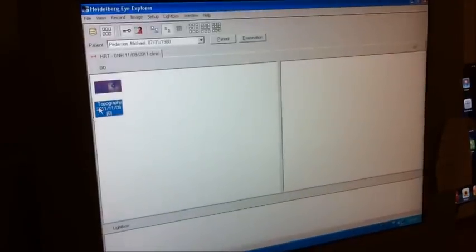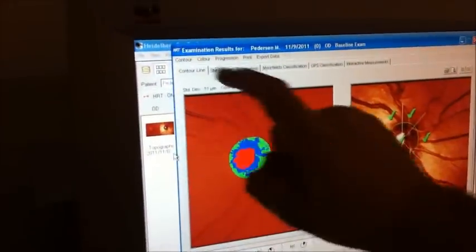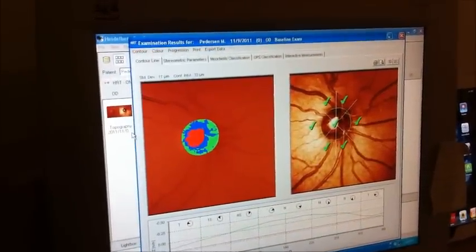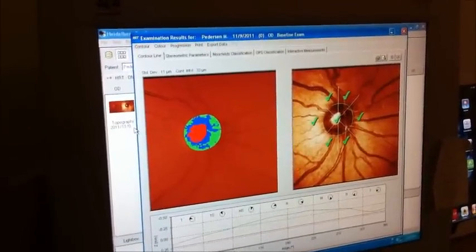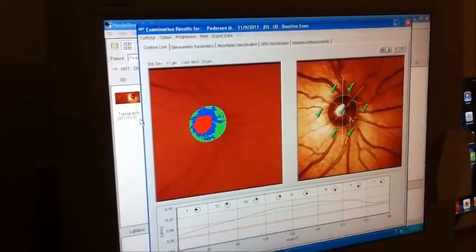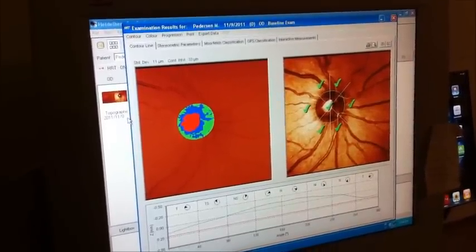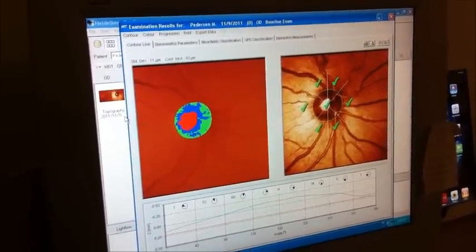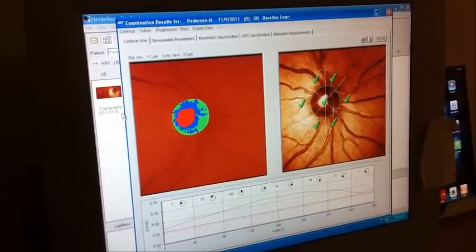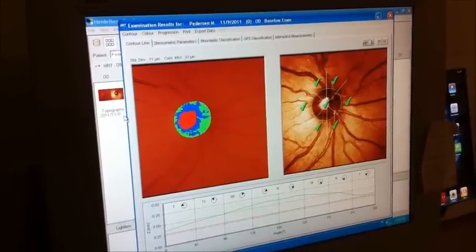That's one eye done — we've got a good scan. The standard deviation of the scan is 11 microns; anything less than 20 microns is a very good scan. That ties into how we determine change going forward. The GDX and the OCT are good instruments, but my big problem with those instruments is they don't provide a measurement of the standard deviation of the scan. In terms of sensitivity and specificity for detecting change, I found no difference between the HRT, the GDX, and the OCT.